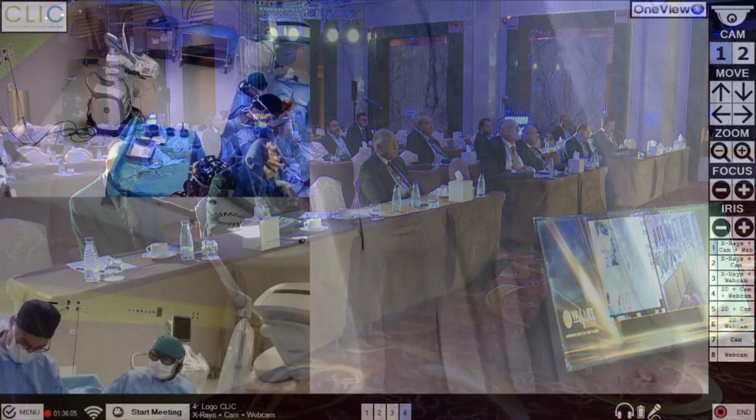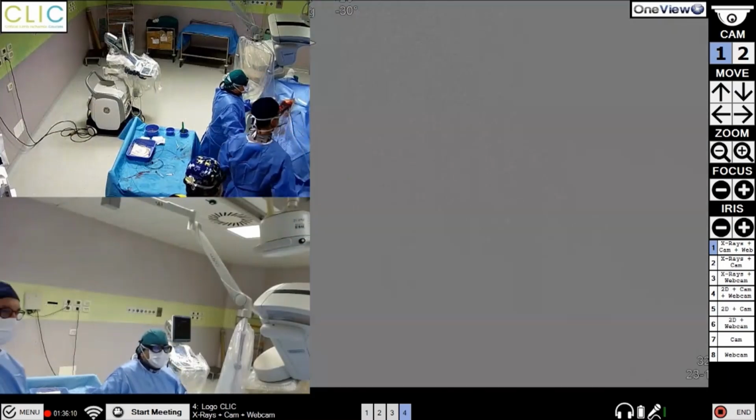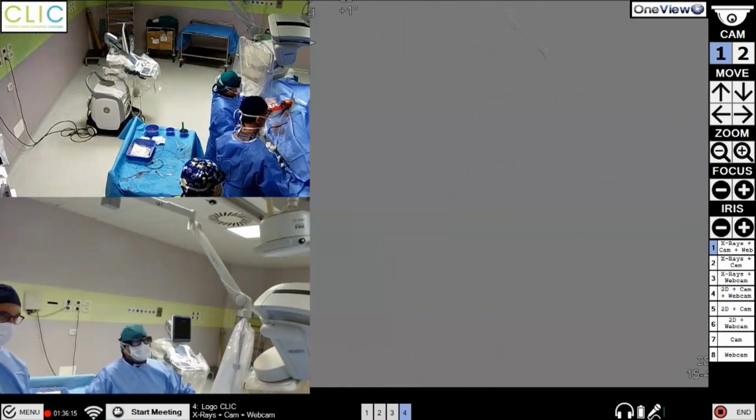Yes, I can hear you. I will show you our progress. So, Nick, I can show you the angiography after post-dilatation of the posterior tibial artery at 2.5.